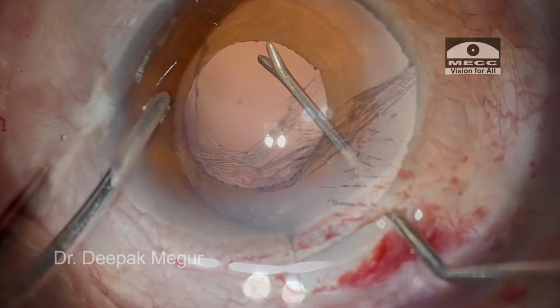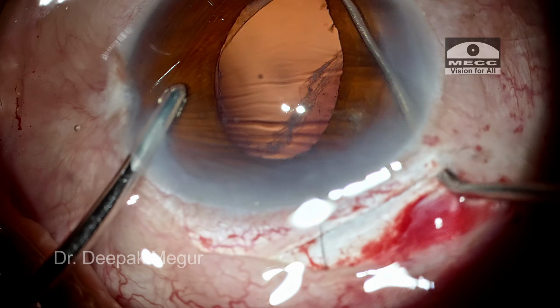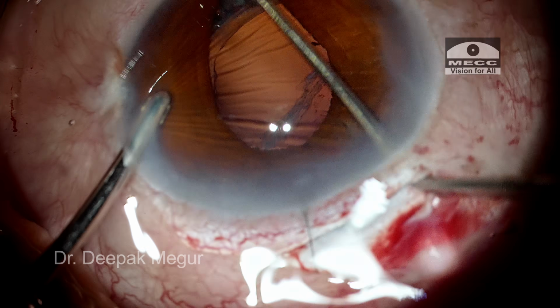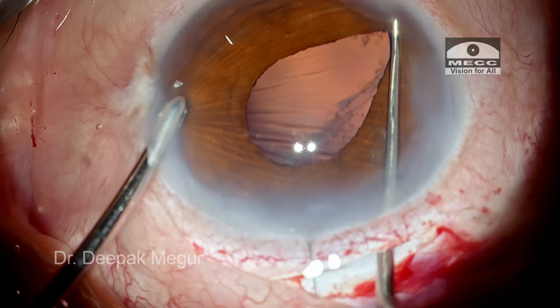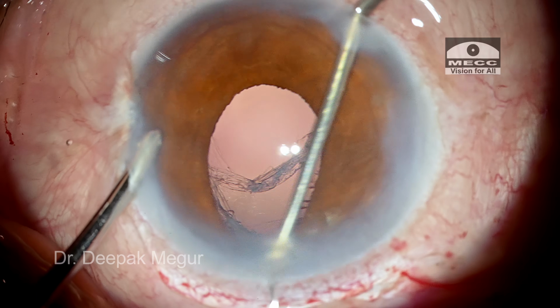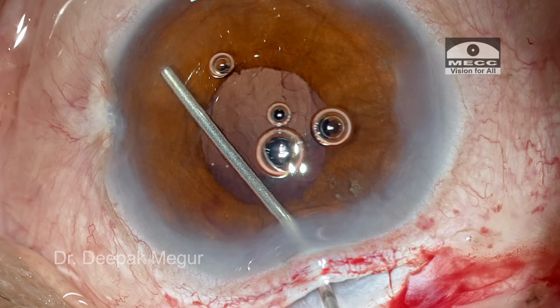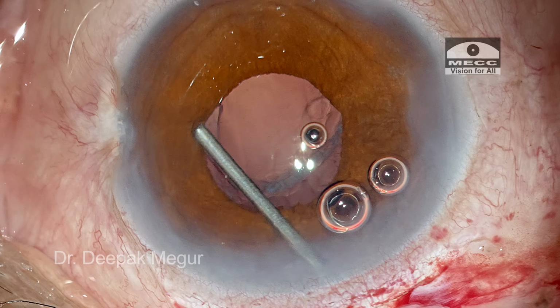intraocular lens. So I'm going to use the Y hooks to retract the pupil just to visualize the extent of the rhexis margin, and I think there is enough support. I am unable to see the edge of the rhexis margin in one third of the circumference of the entire area. So I feel that the sulcus placement of the lens is reasonably safe, and I'm going to use cohesive OVD to create some space between the iris and the capsule.